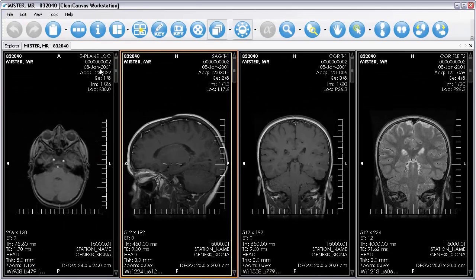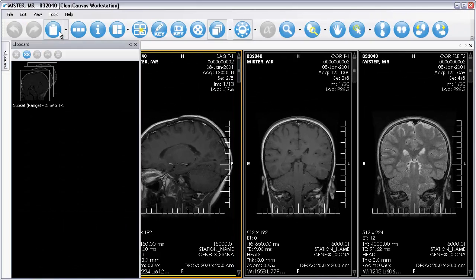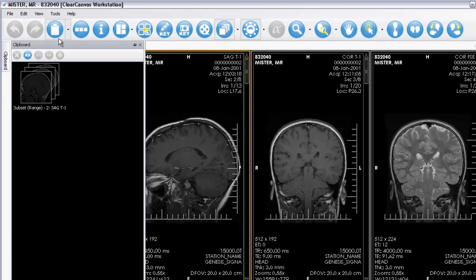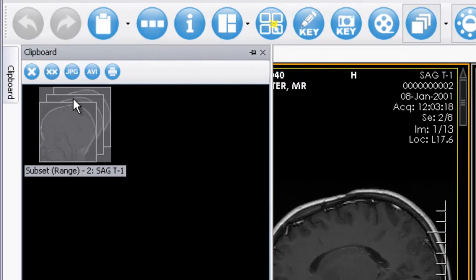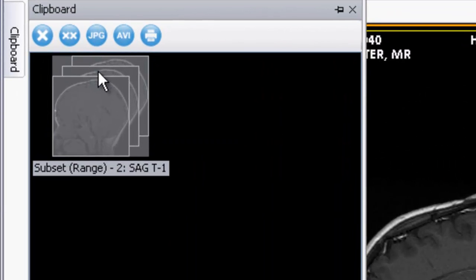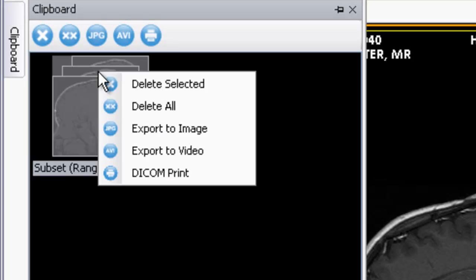Show the clipboard by clicking on the Clipboard Toolbar button. Go to the clipboard and select the images you want to print. Click on the printer icon on the clipboard toolbar, or right-click on the thumbnails and select Dicom Print.